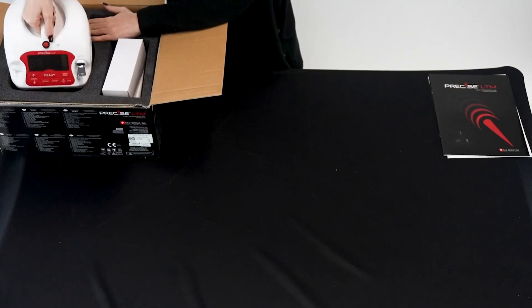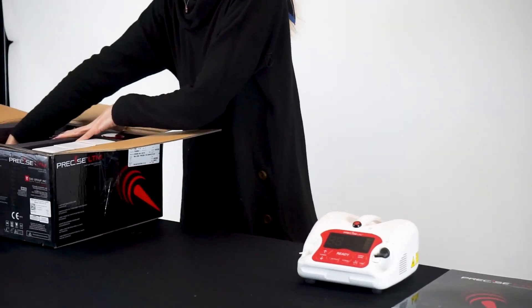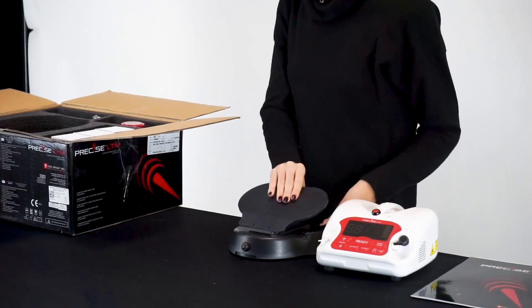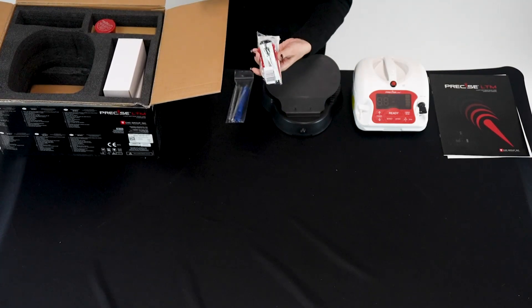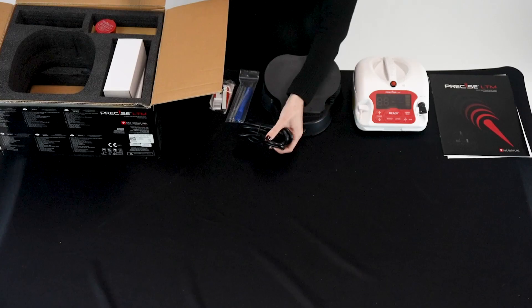One Precise LTM laser, one foot pedal, two autoclavable hand pieces with collete, and one power cord.